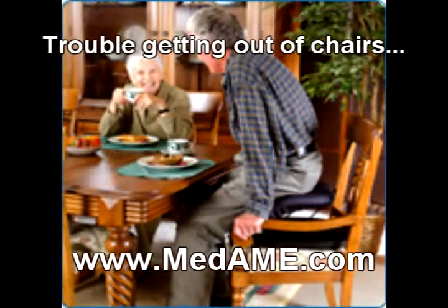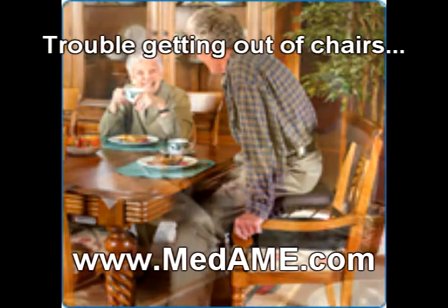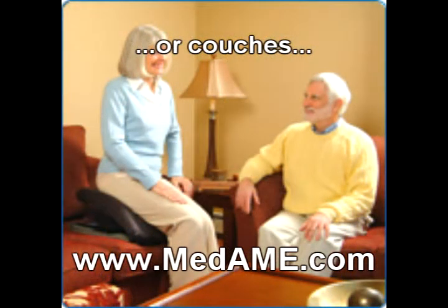Do you find getting up out of a chair or sofa becoming increasingly difficult? The Uplift Power Seat electric powered lift cushion will help you out of any furniture, either at home or while visiting, with a simple flick of a lever.